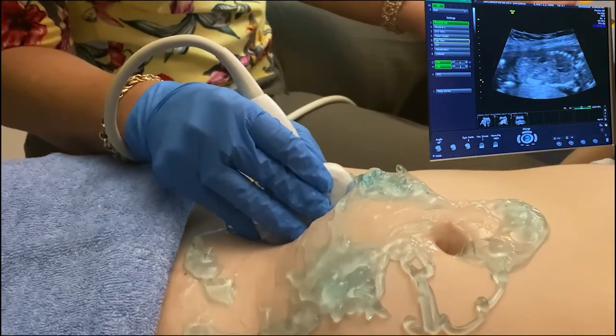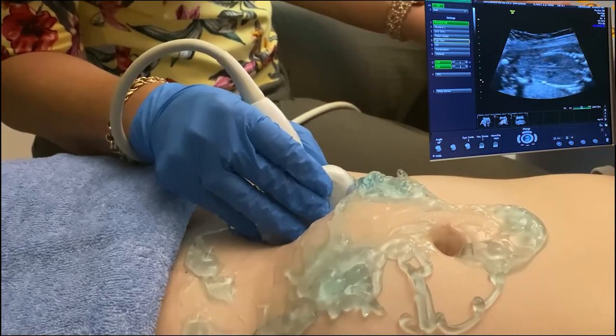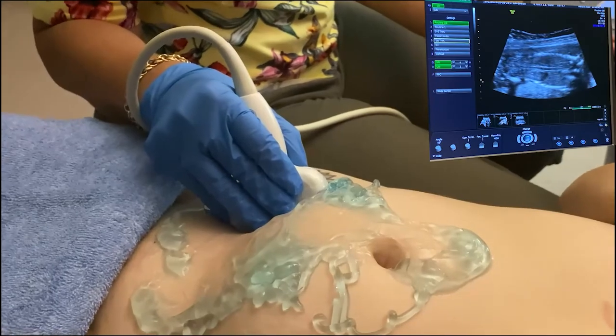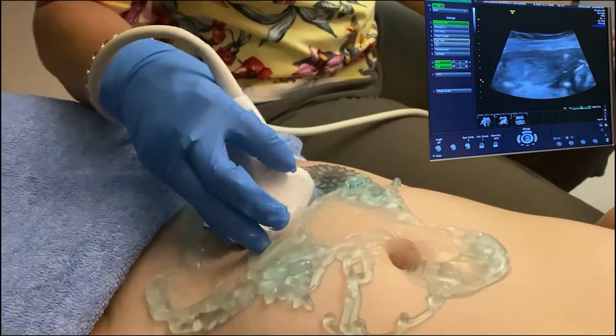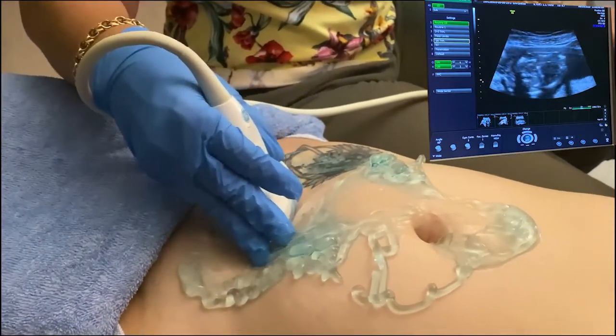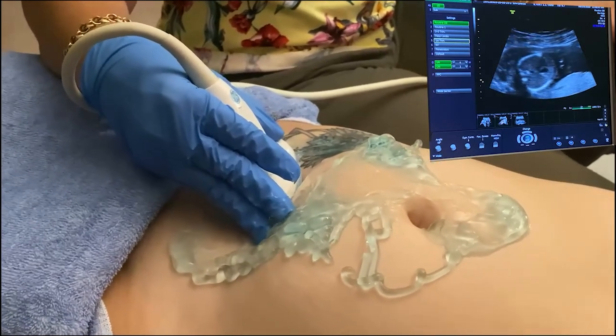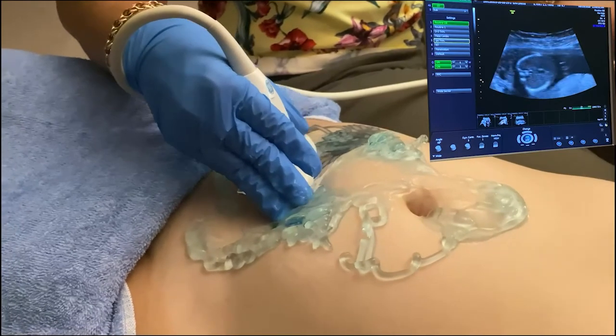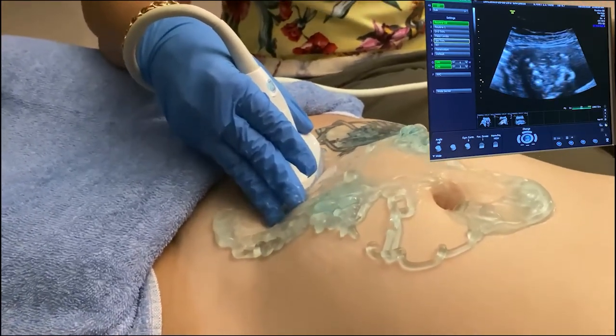Echogenic bowel is a soft marker for Down syndrome in some cases. We can follow this, and we can see the fetal aorta. But primarily we're doing this to establish situs. And we'll start our measurements.